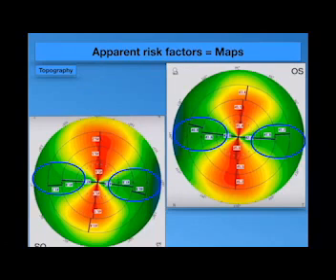So the difference between the superior and the inferior, if the inferior is more by more than 1.5, at the same point at the same level, if more than 1.5, you have to suspect. You have to put an X sign on it and suspect this patient's topography.